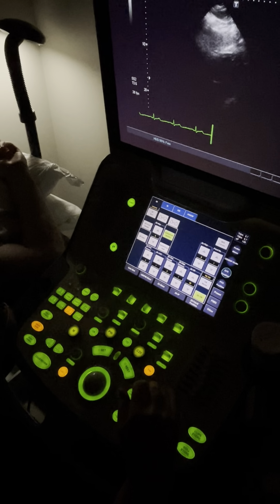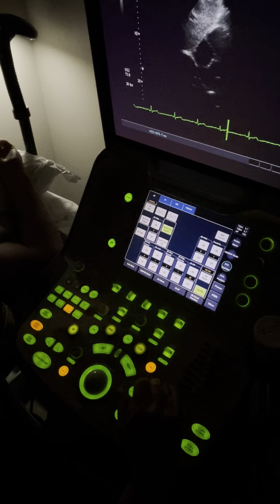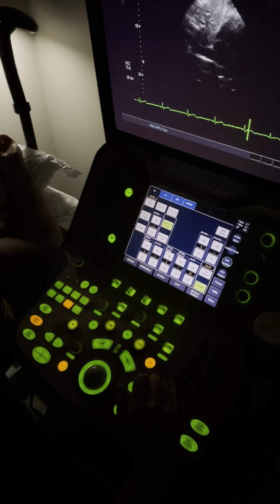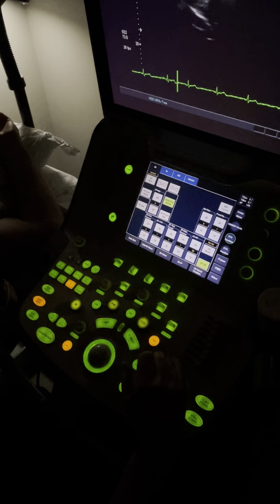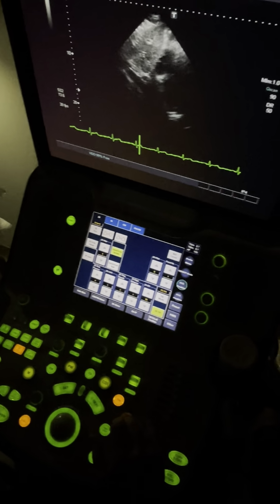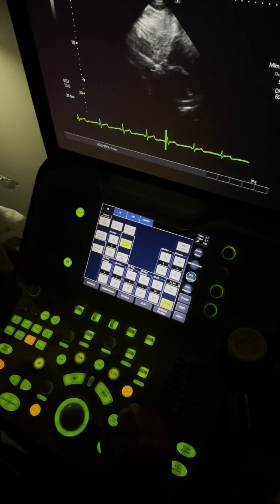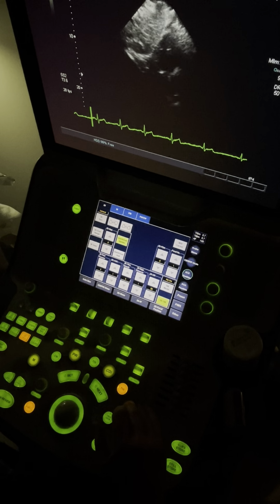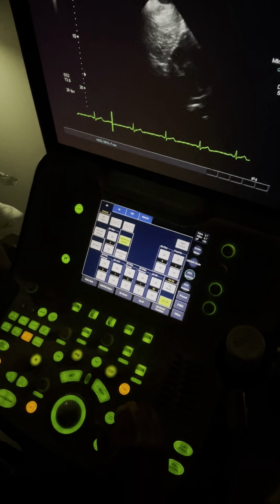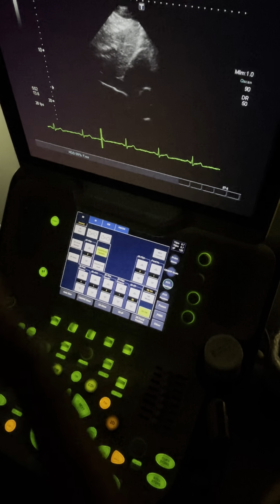Okay? Now, I lost you. Take a deep breath in again for me. Hold it. Now while he's got it held, I'm gonna rotate and pull in. There's your IVC. Sniff, go. Good. Nice. Okay? And then I'm gonna angle down. There's the aorta. You can breathe if you have to. Okay, so there's IVC, aorta. IVC dumps into the right atrium.